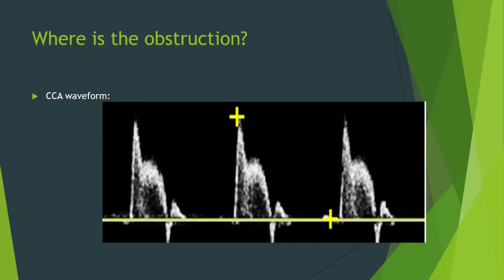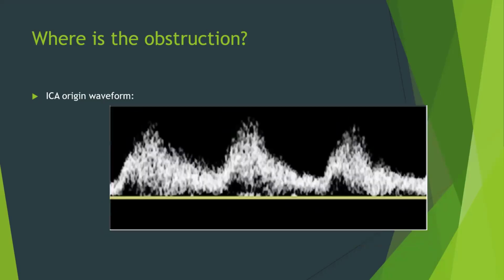Yeah, good. Distal to that CCA would be the correct answer. Specifically, what I would think in this case, if we were to get this waveform in our common carotid artery, is that we're having both ECA and ICA probably occlusions. The reason is that if that ECA were open, we'd probably still have some end diastolic presence. It might still be a little bit low resistive here. So this could possibly be both ECA and ICA, or a very, very distal CCA. All right, let's go to our next one.